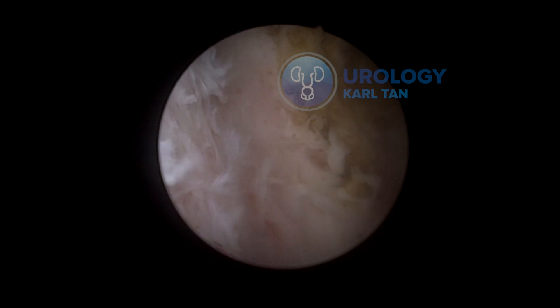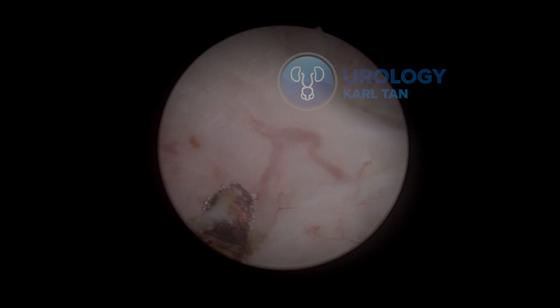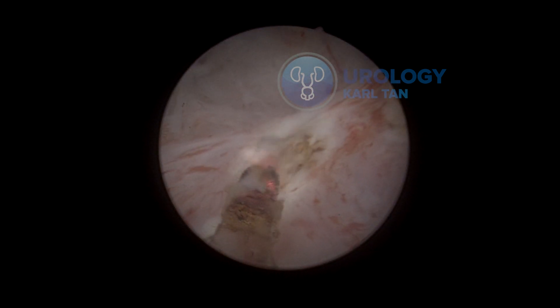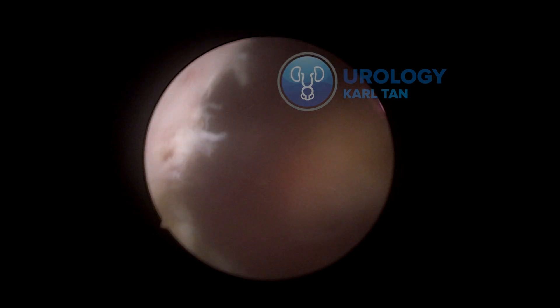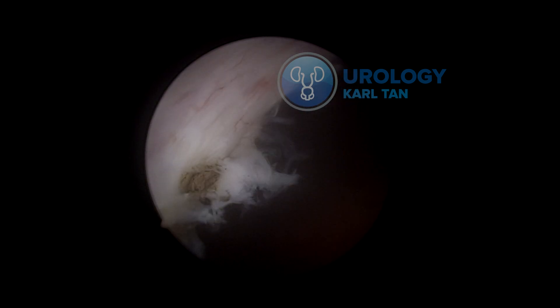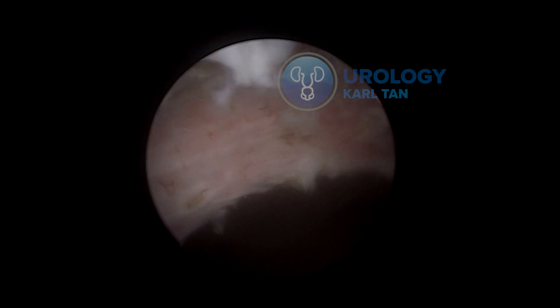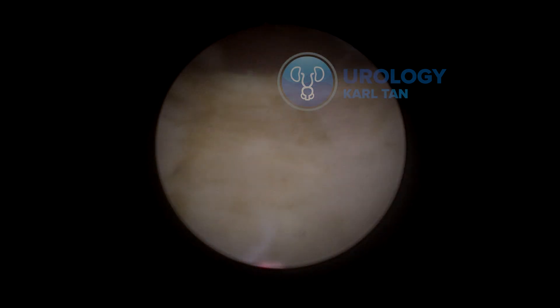After releasing the gland, I try to control pinpoint bleeders to have a clear view when doing the morcellation. Be careful not to press your laser into the tissue because this is a contact laser compared to the holmium — you might perforate into organs we don't want to incise. To check bleeders, I would turn my inflow on and off to know where the bleeding is coming from, because too much flow pressure would prevent small bleeders from showing up.